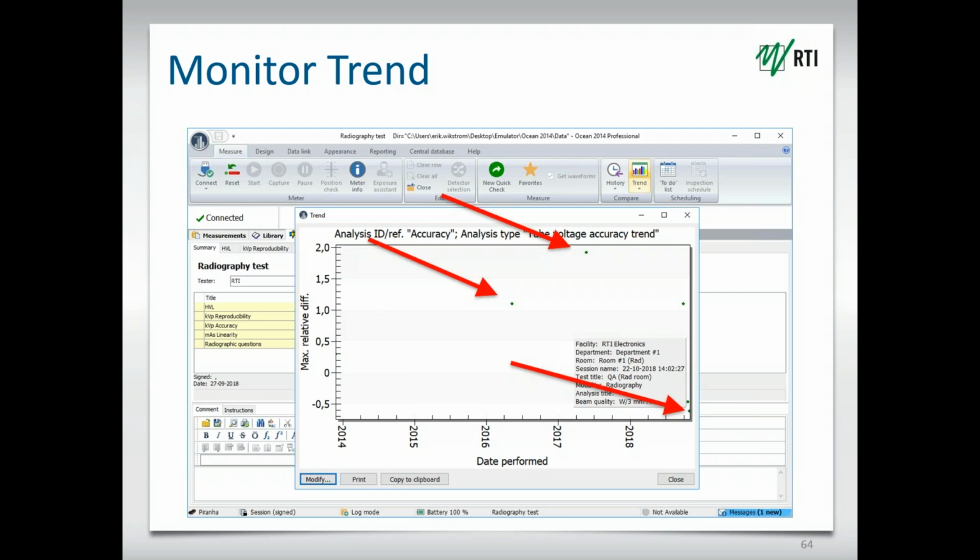And we hope that this will catch on also in the future, to improve the efficiency in the work on the QA in such a way as to be able to predict problems that they're having. That will then reduce downtime, of course, and then reduce the waiting time for patients, which is the ultimate goal for all of us in this business.